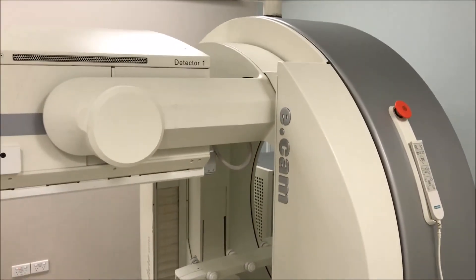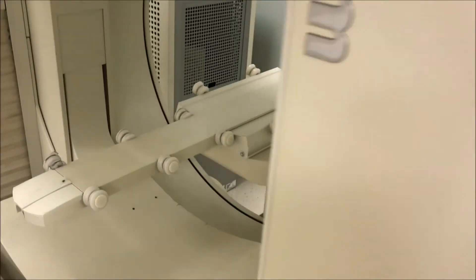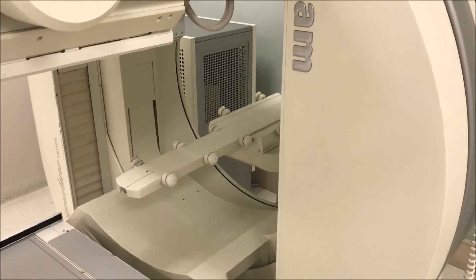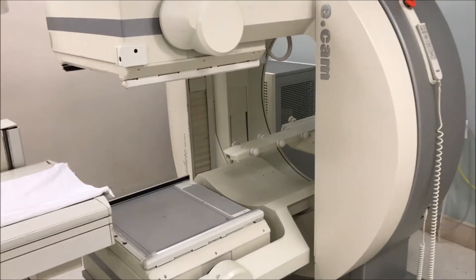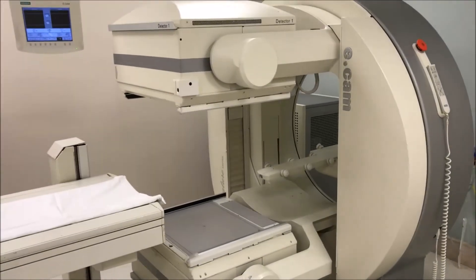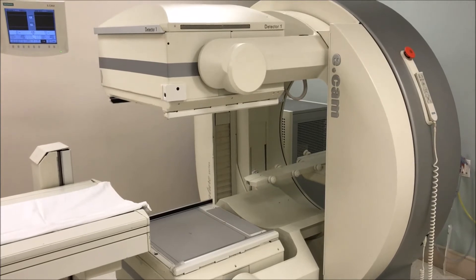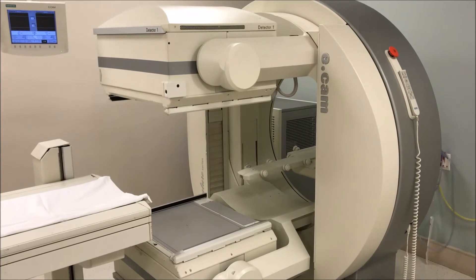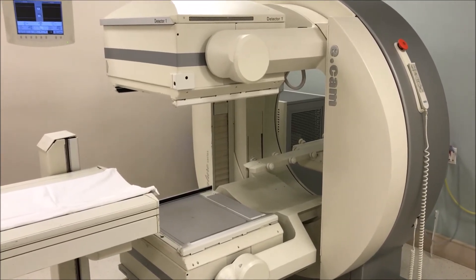The next system after this is the GE Hawkeye. Around this location on the gantry it actually has an X-ray tube that goes over to the other side where there's a detector — a rotating low-resolution X-ray system that allows low-resolution CT for attenuation correction and localization. That's the next generation after the Siemens ECAM, and then we'll move through to the higher-end SPECT-CT.